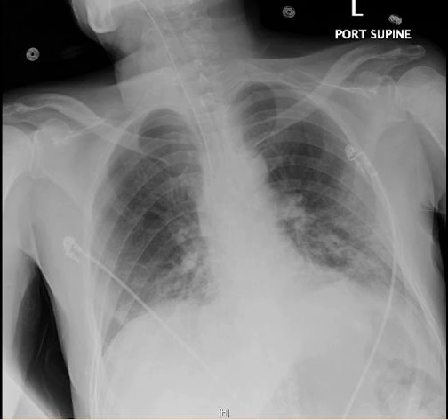So the final thing let's talk about is we know now that X-ray is the least sensitive. Ultrasound is more sensitive than X-ray for COVID, and CT scanning might actually be more sensitive than the PCR. So what do you do with that knowledge? While it's really great to know the patterns and to understand what you might be looking at, I think for most of us as clinicians, we have to ask if what we're doing with getting imaging is actually going to change management.